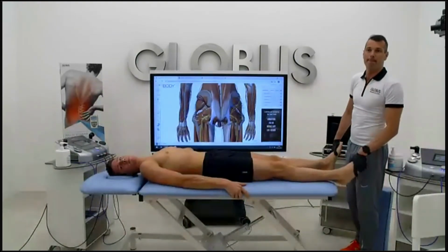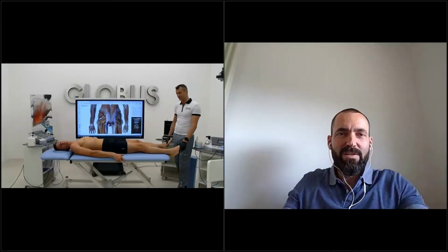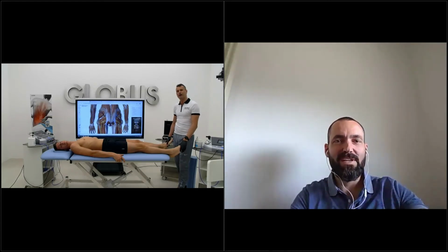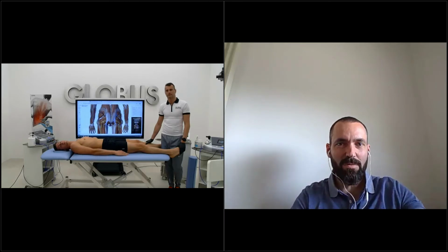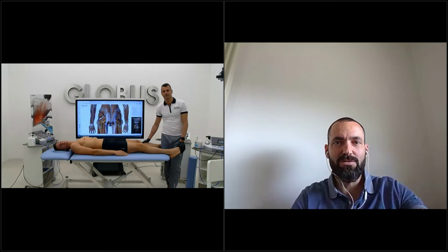What do you suggest? No, I think you have already very good results with this treatment. It's really true that the piriformis is a good muscle to treat in this way, because this muscle gives us good satisfaction. When you make the treatment, you go deep, you improve temperature, you have this decrease of tension, and you test just after 10 minutes, you see already the difference. So of course, this is a good way to treat.